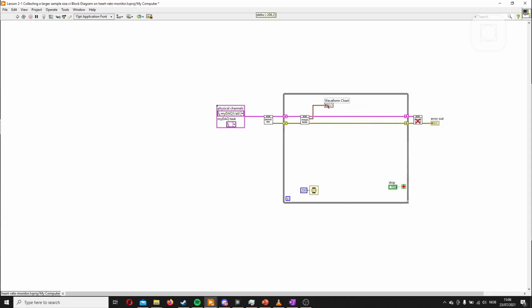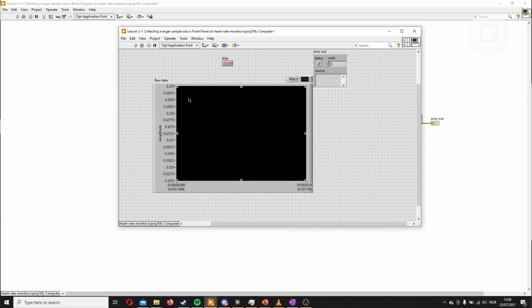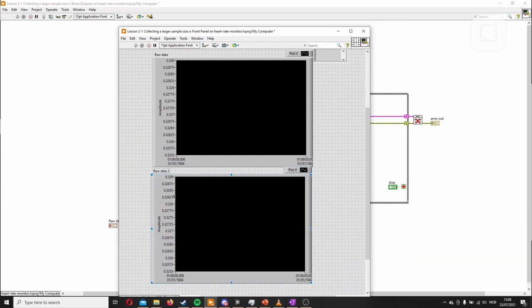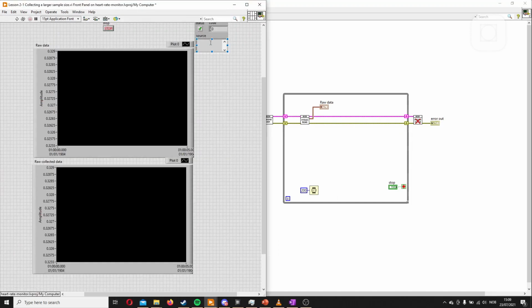We'll keep this waveform. We'll start by renaming this to just raw data. And then we'll make a copy of it, but we'll make it a little bit larger before we do. And then let's make this one a bit larger too. We call this one the raw collected data. So now we have two. And we can just put it to the side here. We can move these things here. Make this stop a little bit bigger. Not necessary, but let's do it. And then move it here.